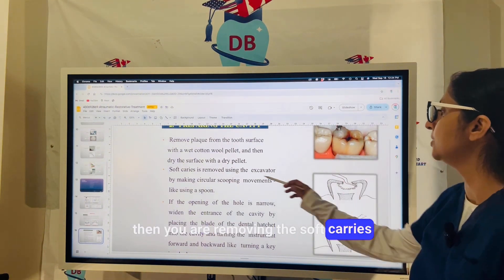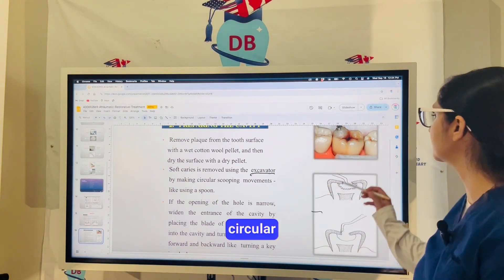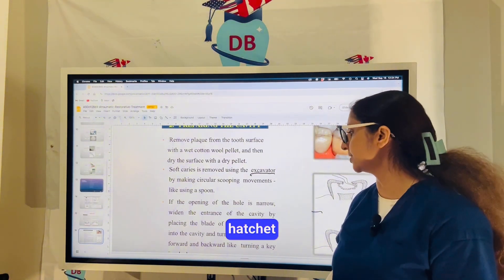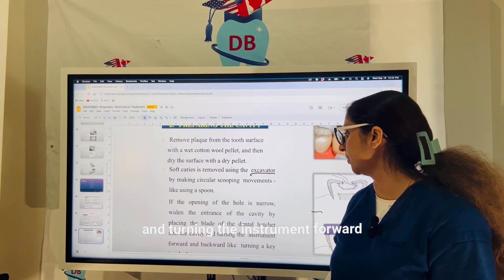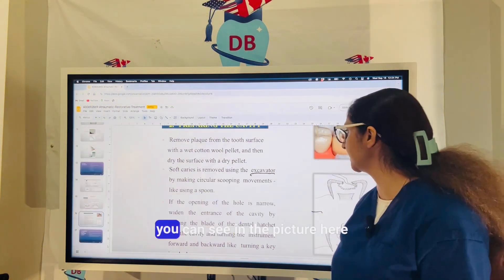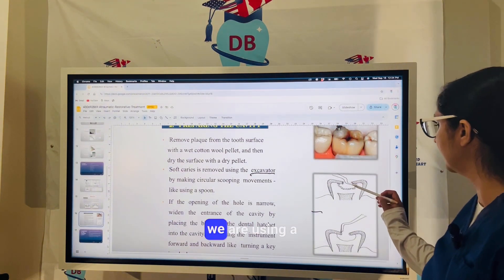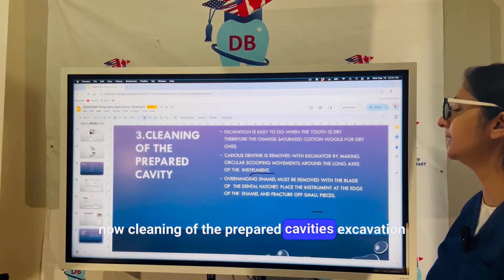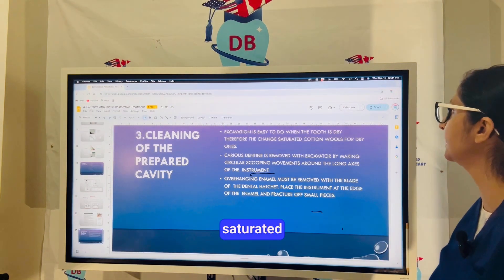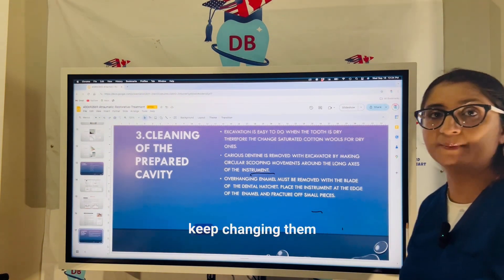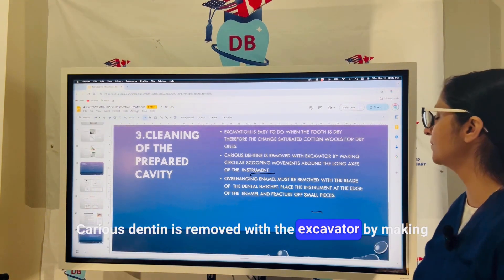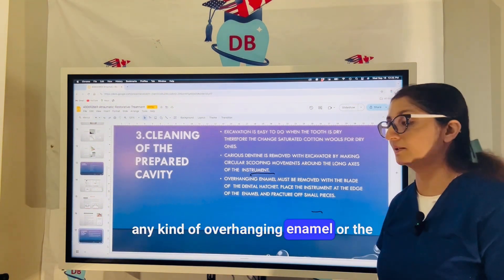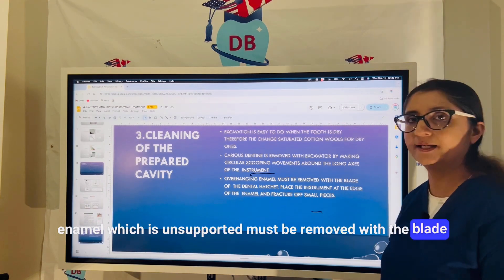Soft caries are removed using the spoon excavator with circular scooping motions. If the opening of the hole is narrow, the entrance is widened by inserting the blade of the hatchet into the cavity and turning the instrument forward and backward like turning a key, as seen in the picture. Excavation is easier when the tooth is dry, so cotton wools should be changed regularly. Carious dentine is removed using circular scooping movements around the long axis, and any unsupported enamel must be removed with the blade of the hatchet.